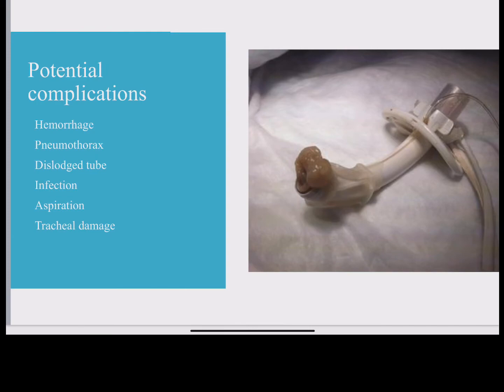So, what if you have a confused patient or child who decides to pull their entire trach out? This is like the absolute nightmare of all tracheostomies. The most common reasons for accidental dislodgement are altered LOC, turning your patient, copious amounts of secretions, and poorly secured trach ties.